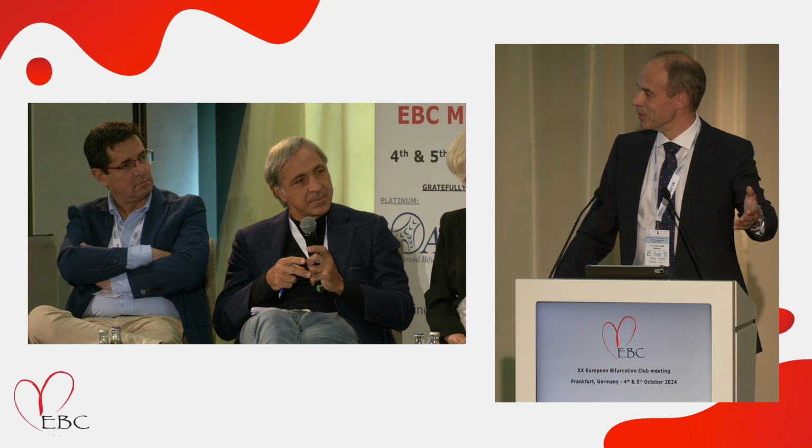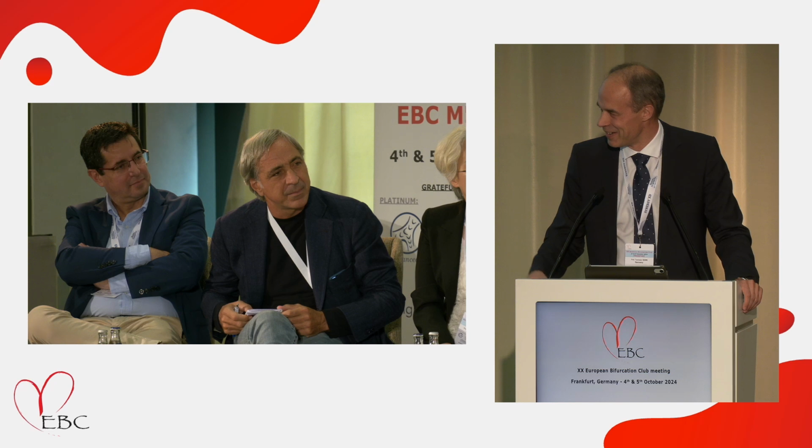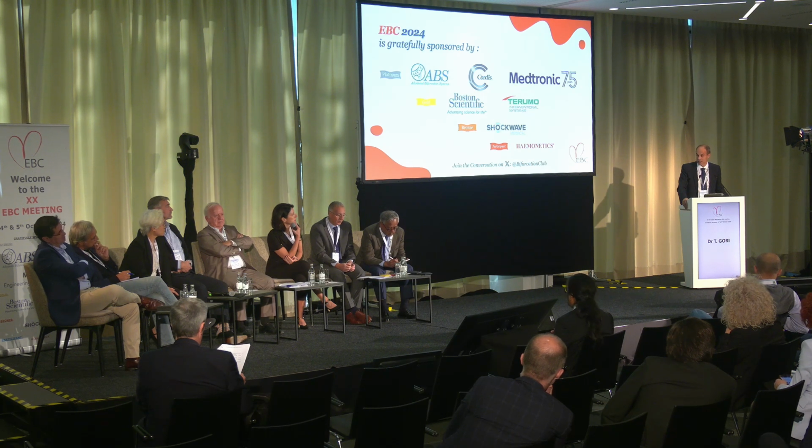I have just a question. We have learned from the OCTOBER trial that unintended stent deformation by OCT occurs in at least 5% of complex bifurcations. Any case in your study? Yeah, if I had known that there was this endpoint, I would have used it in the study. Actually, I found it a very instructive presentation. Yes, there were stent deformations, and I would say that they were more frequent in the DK Crush group, but I cannot substantiate this statement. I'd rather not say anything about it.